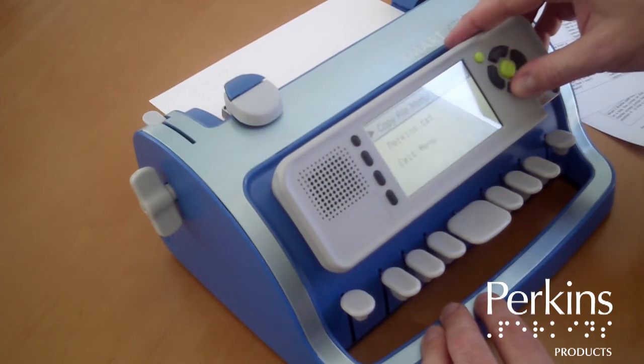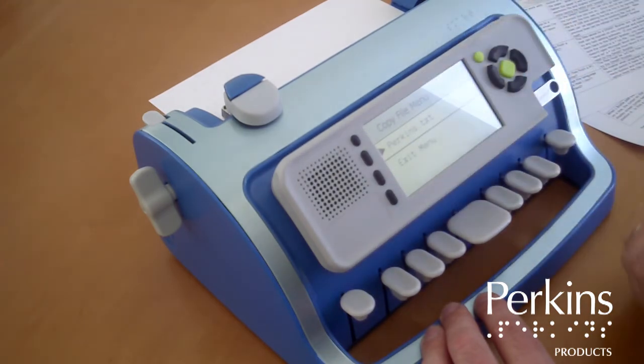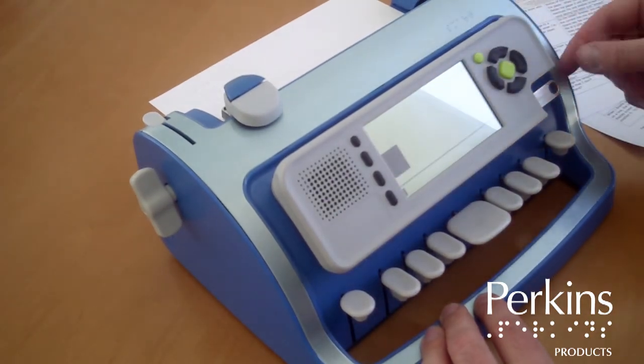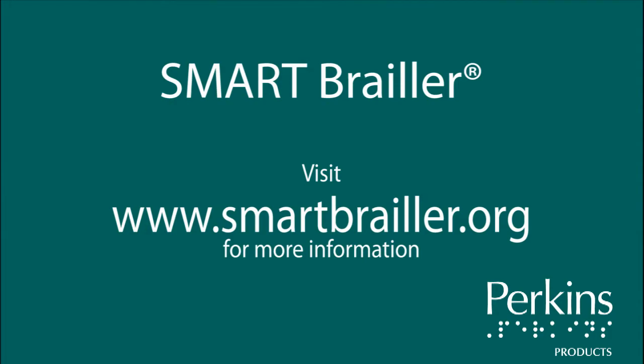In the Copy File menu, select Perkins dot text. The device confirms: Perkins dot text has been successfully copied from memory to USB. Visit SmartBraille.org for more information. Thank you.